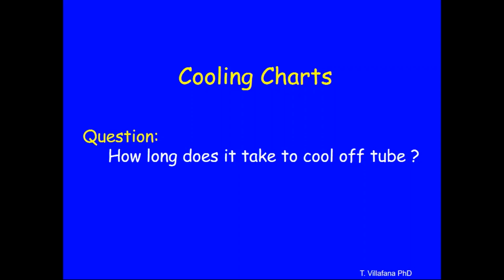But now the question comes up: I went through a particular series of shots, the tube is red hot, how long do I have to wait before I can expose again? This is where the cooling charts come in. How long does it take for tubes to cool off?